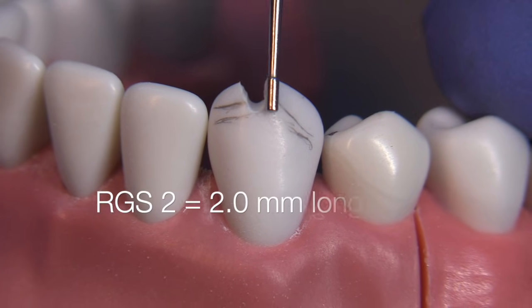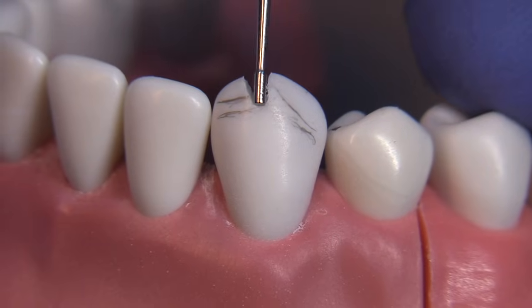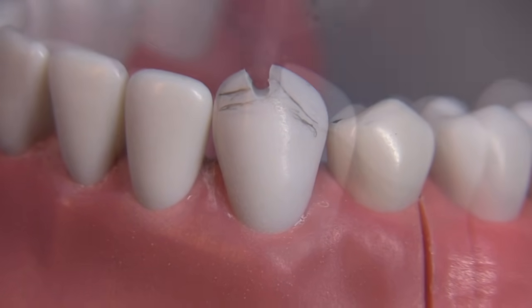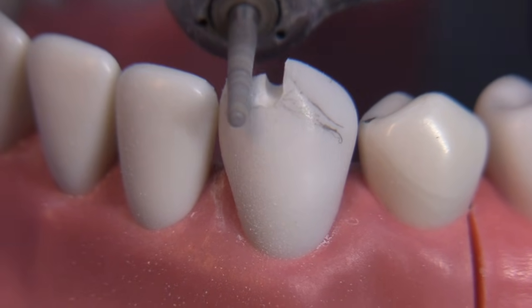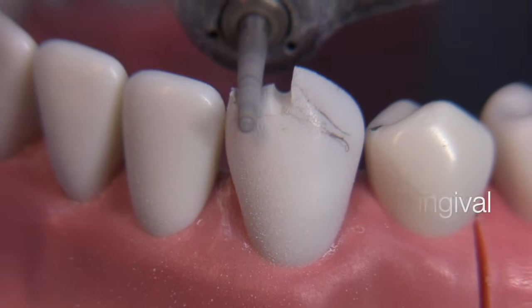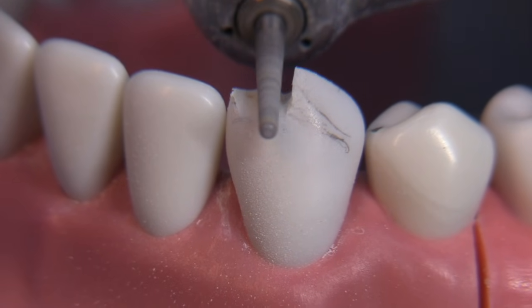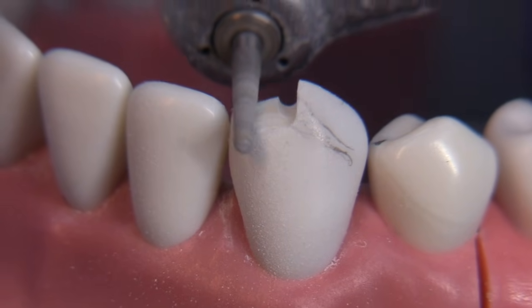Using the RGS2 here to show the reduction made so far. The bur is angled towards the facial gingival just a little bit, which will facilitate clearance with the opposing lingual surface.